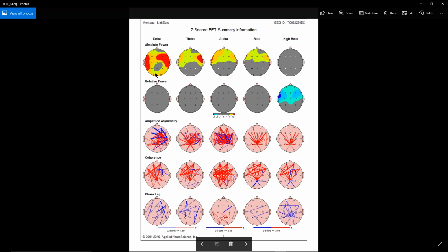There are a variety of choices that would get at her memory issues, her vertigo issues, because that would be inclined to be temporal lobe activity. Memory issues would be frontal, so I could address those frontal issues. And so the choice of location is based on a combination of the findings from the assessment and the client's presenting symptoms.